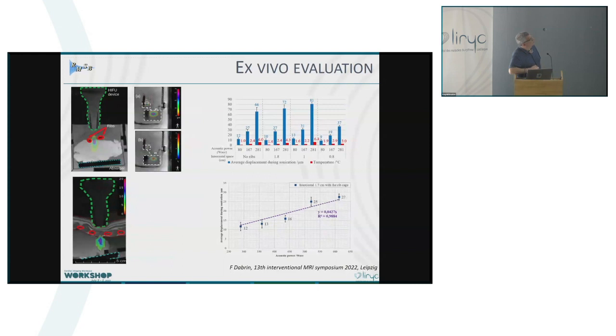So what you can do with that to characterize your device, for example, here you have an example of, oh, I should finish. Okay, this is not my last slide, my last is the next one. So you have an experiment here where you put a sample, we put ribs next to that, and you have your transducer sonicating here. What will you do? You change the intercostal distance between the two ribs to see up to where you can go, and can we sonicate in between the ribs.